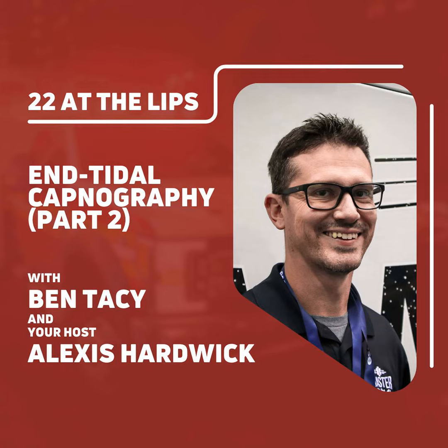Even though all the numbers look beautiful, my oxygen level can be at 100%, but during anaphylaxis my airway is tightening. So it's making the most out of the vital signs that you have, but adding something else in the mix.